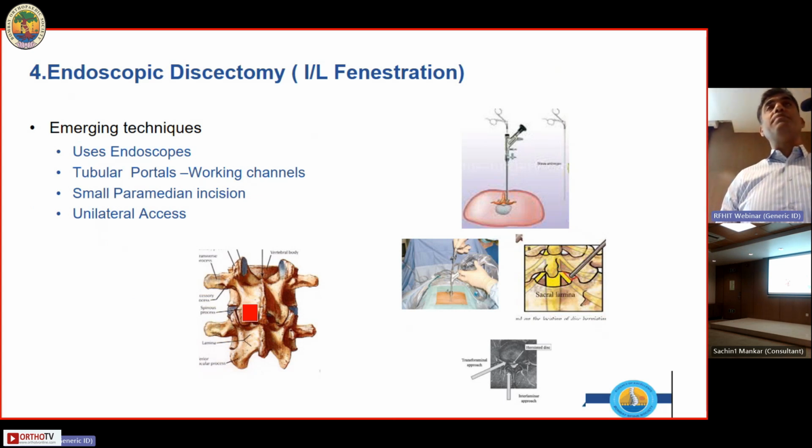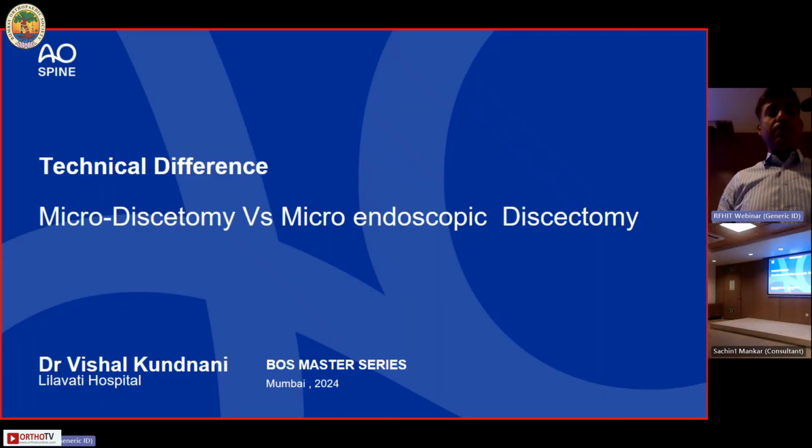Again, the surgery part of it, the definitive decompression discectomy part of it, bringing the fragment out, that definitive surgery which actually brings pain relief, remains the same. It doesn't change at all. And the technical differences are all about how you do the access part of the surgery.